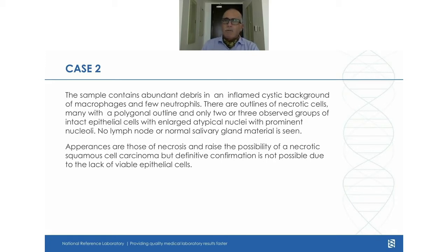So we can run the poll now, and in view of the clinical information, in view of this cystic background with cells which are not that easily identifiable, I would be interested to know what your impression is. I understand that you haven't been shown that many images, of course, but this is not a test. It's just for the sake of discussion, actually.